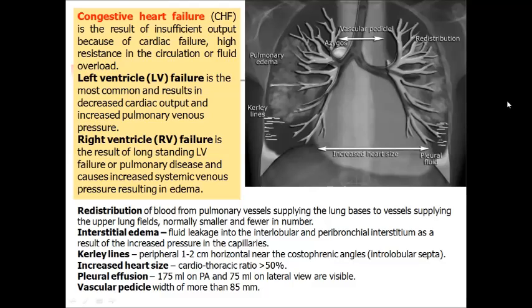pulmonary fields and increased pulmonary venous pressure, and edema as a result of it.